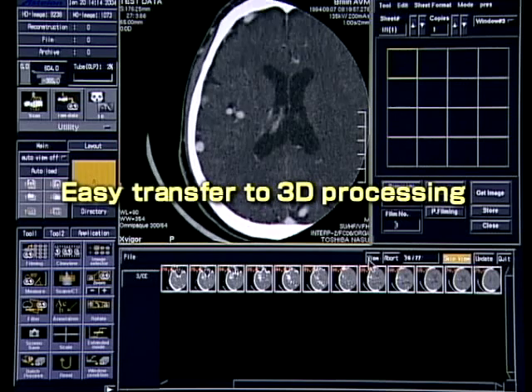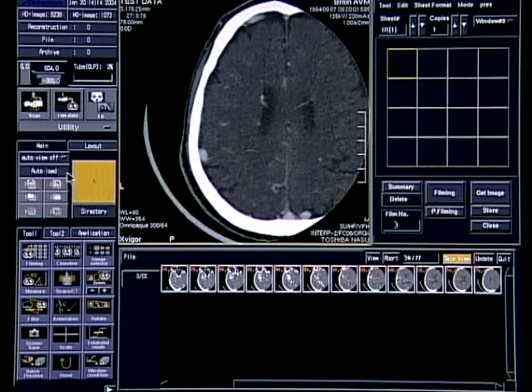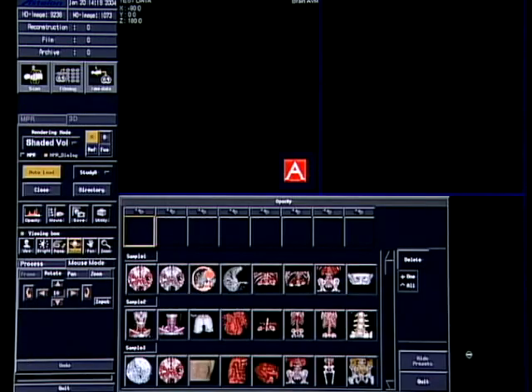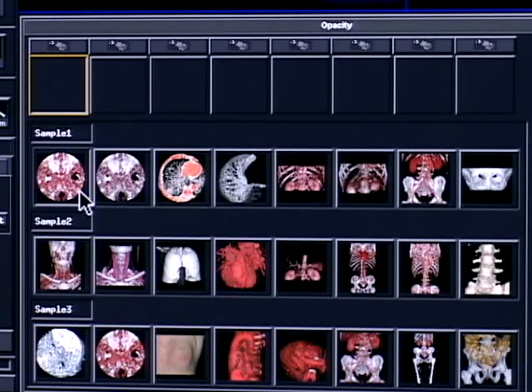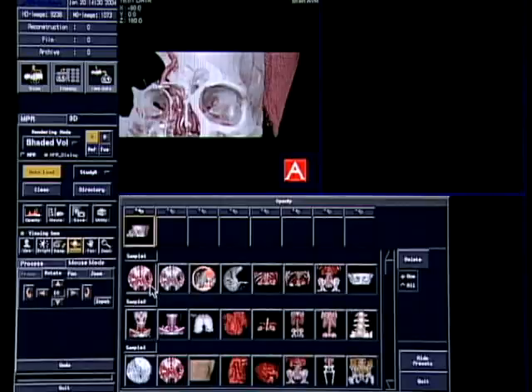It is not necessary to return to the image list to generate 3D images. It is possible to move directly from axial image display mode to 3D image display mode. The optimal conditions for 3D image generation can be preset on templates, and the 3D image is then generated by a single step operation.